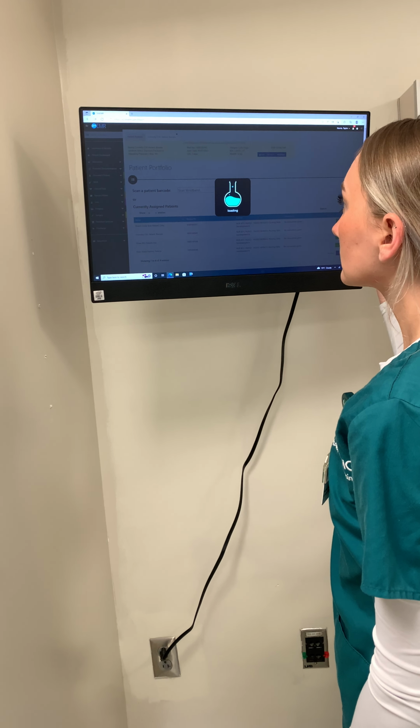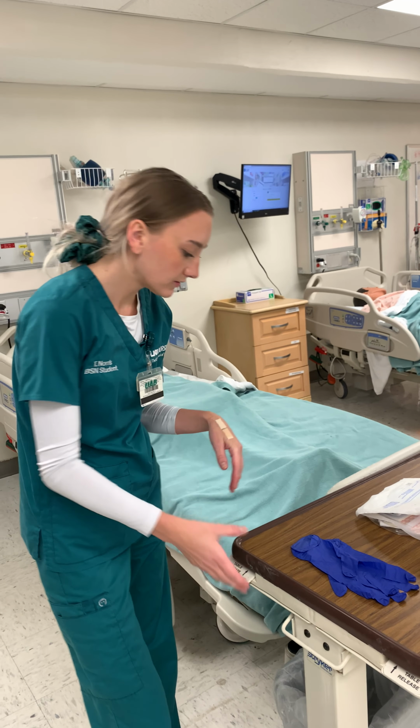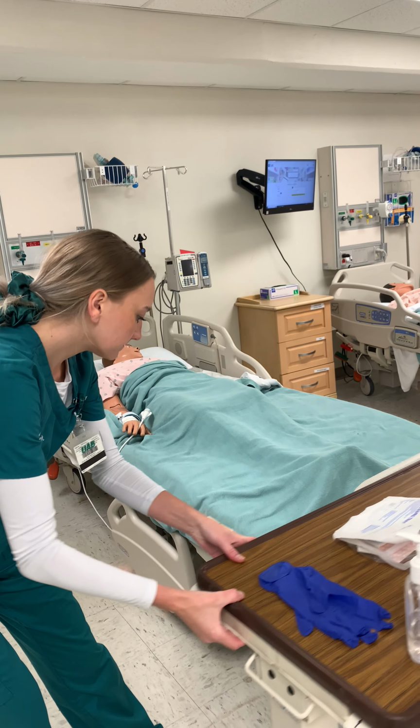All right, and then I'm going to get you to verify your name and date of birth for me. I would check that with the wristband as well as my medical record just to make sure that it matches. All right, and then we will proceed. All right, so I'm going to go ahead and perform hand hygiene and gather all my equipment.